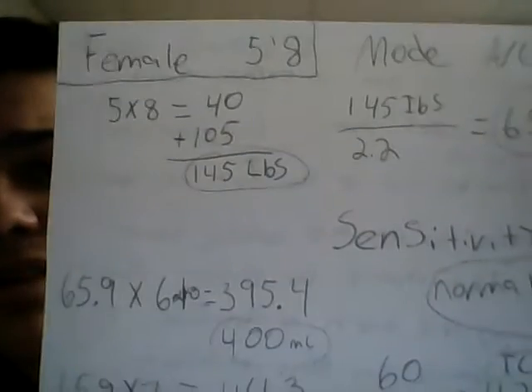But before we put the patient on the ventilator, we have to put certain parameters into the settings. To figure out what these parameters are, you have to do some math. So I actually came up with an example here. I picked a female, 5'8". The mode would either be assist control or SIMV.